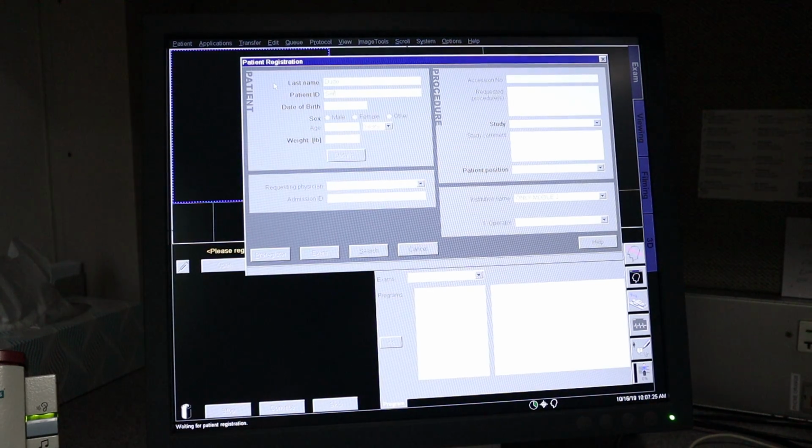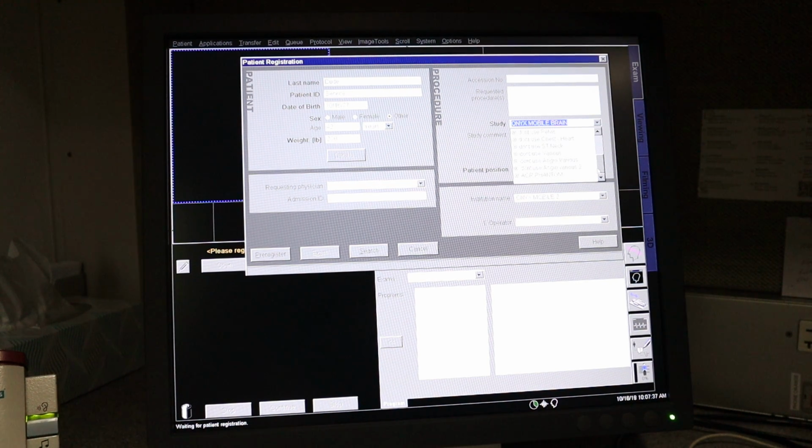Patient, I use a service dude. Don't worry about the date of birth. Just going to put an age, a weight. We're going to do a head. Just try that here, brain. And head first supine, exam, confirm.